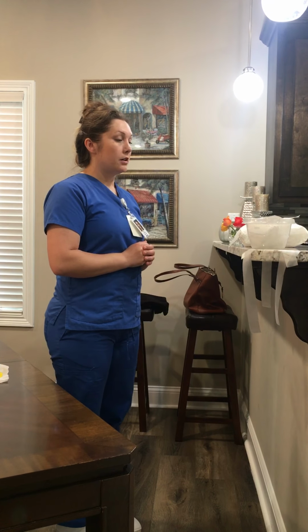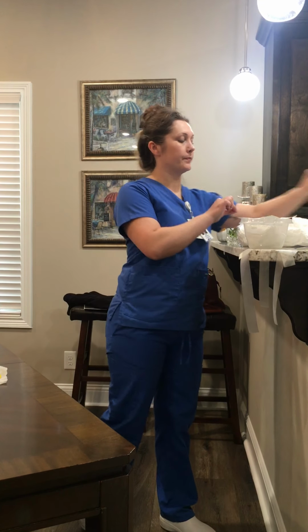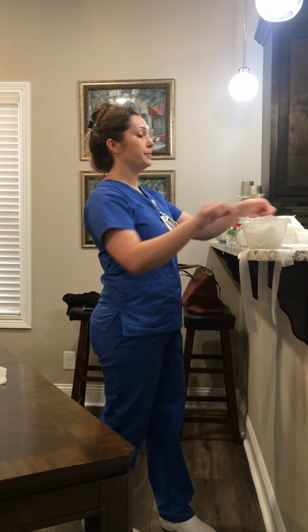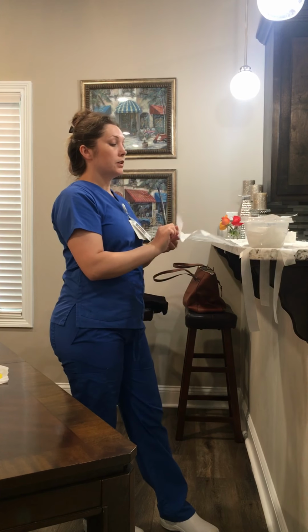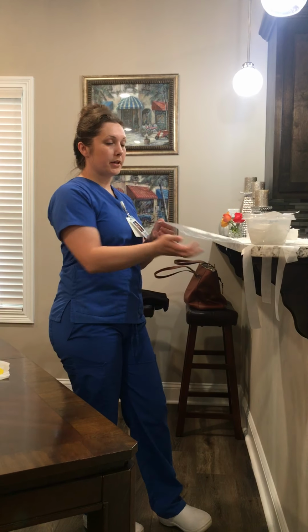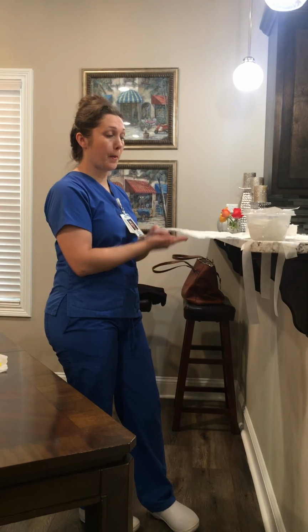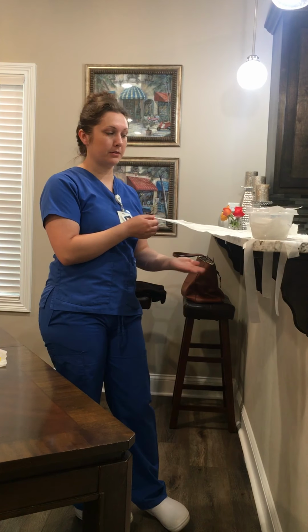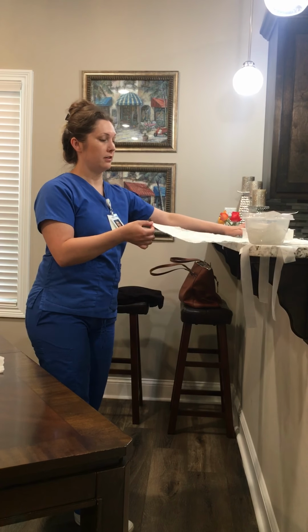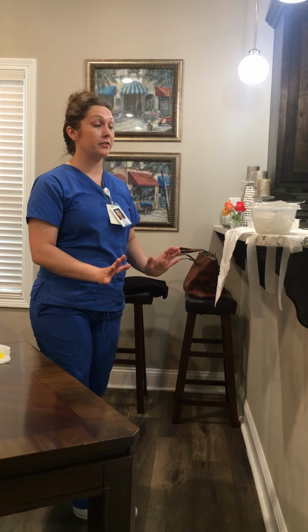So now that I have everything that I need, I'm ready to open up my sterile field. I'm going to open this away to the side and towards me. So just because this table doesn't come out all the way, this should never go below. But this is just what we have right now. So I just want to clarify that this would not go below, because you don't want to contaminate your sterile field.